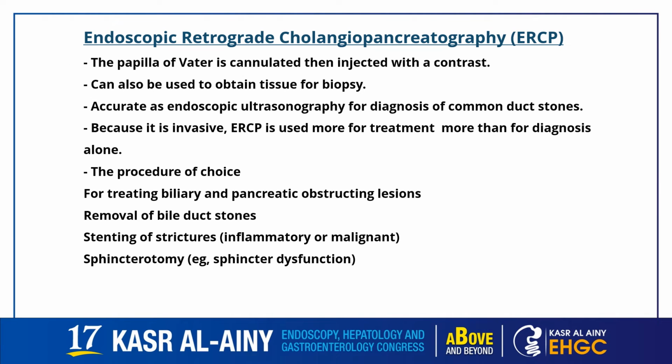ERCP: the papilla of Vater is cannulated and contrast is injected. It can be used to obtain tissue biopsy, and is as accurate as endoscopic ultrasound for diagnosing CBD stones. Because it is invasive, ERCP is used more for treatment than diagnosis. It is the procedure of choice for treating biliary and pancreatic obstructing lesions, removal of bile duct stones, stenting of strictures, and sphincterotomy.